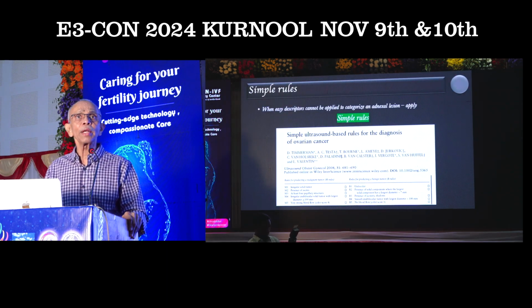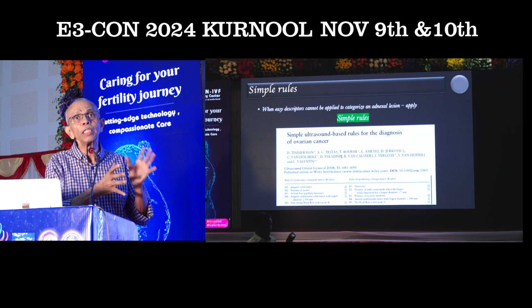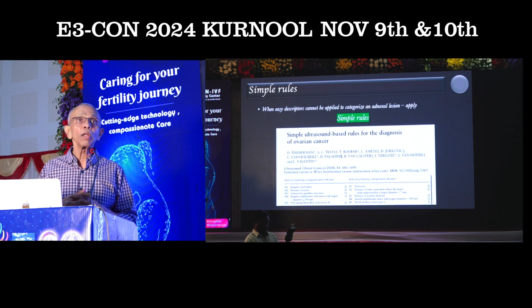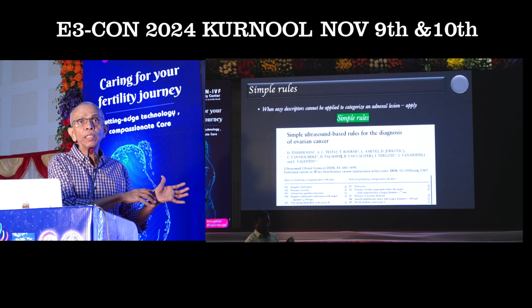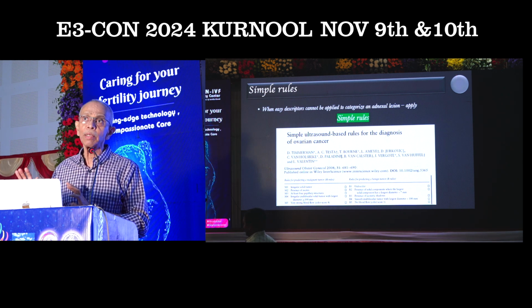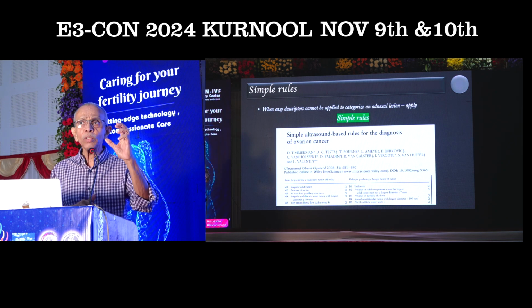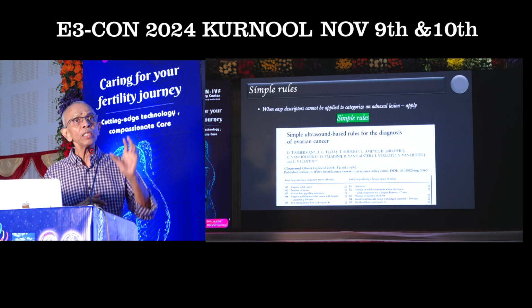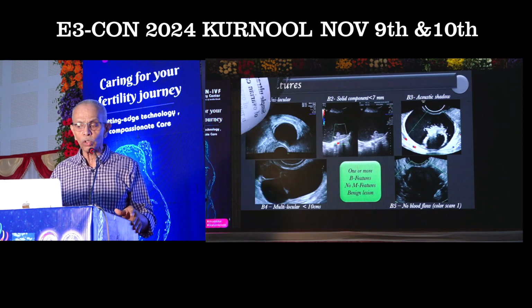Okay, now we have tried the pattern recognition, but there are certain adnexal lesions which are not going to fall into this pattern recognition. In that situation, what are we going to do? We are going to depend upon what are called the simple rules. These simple rules are categorized as M features and B features. M features are nothing but the malignant features. B features are nothing but the benign features. The features which are highly suggestive of a malignant lesion are called M features. The features which are suggestive of a benign lesion are called benign features. So I'll show you some examples so that you can understand.